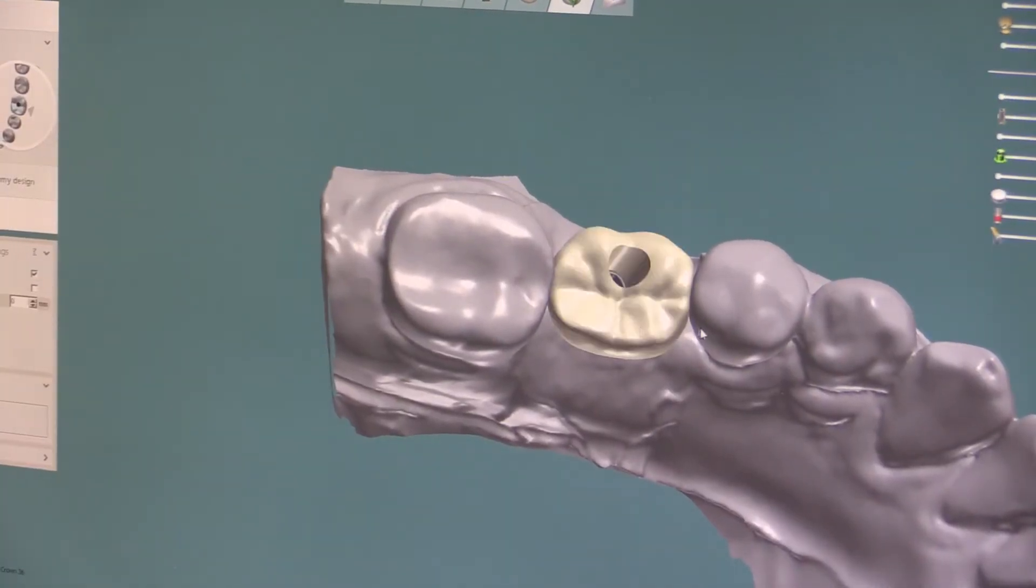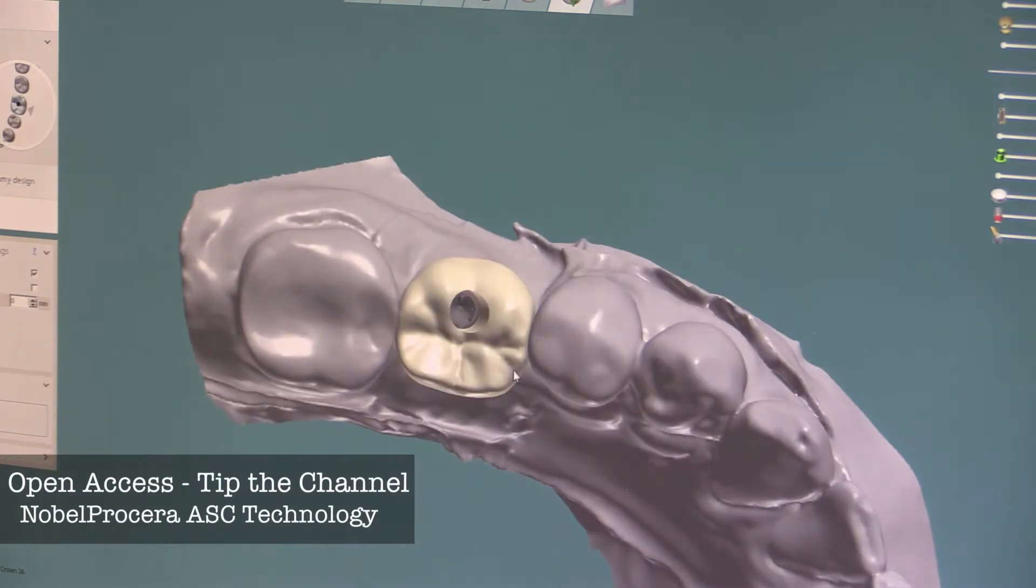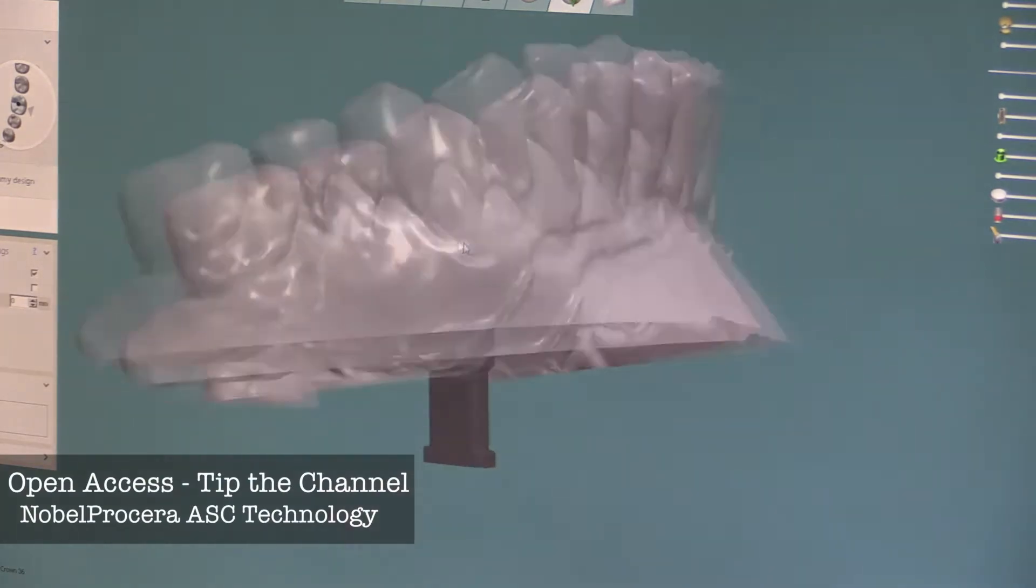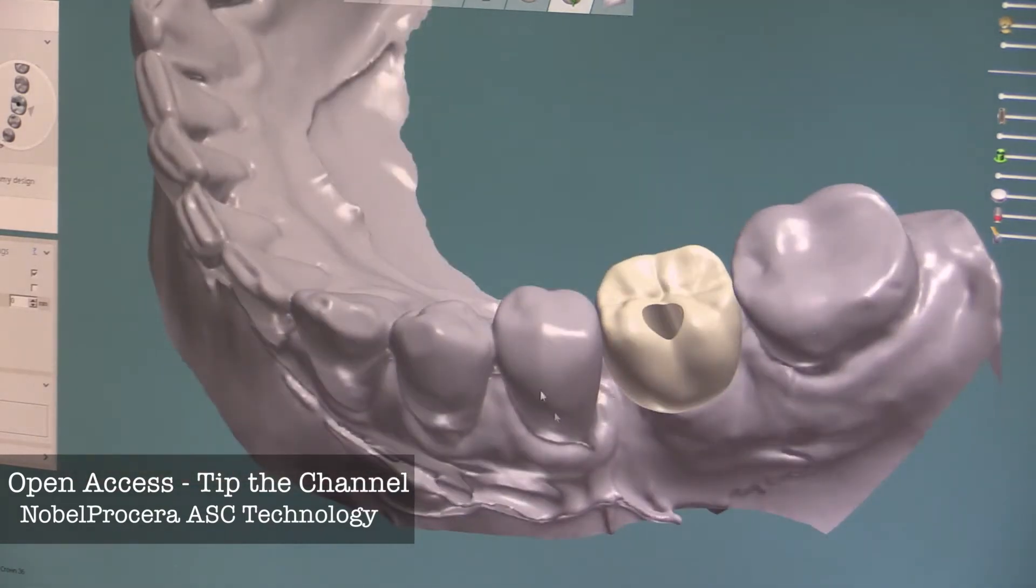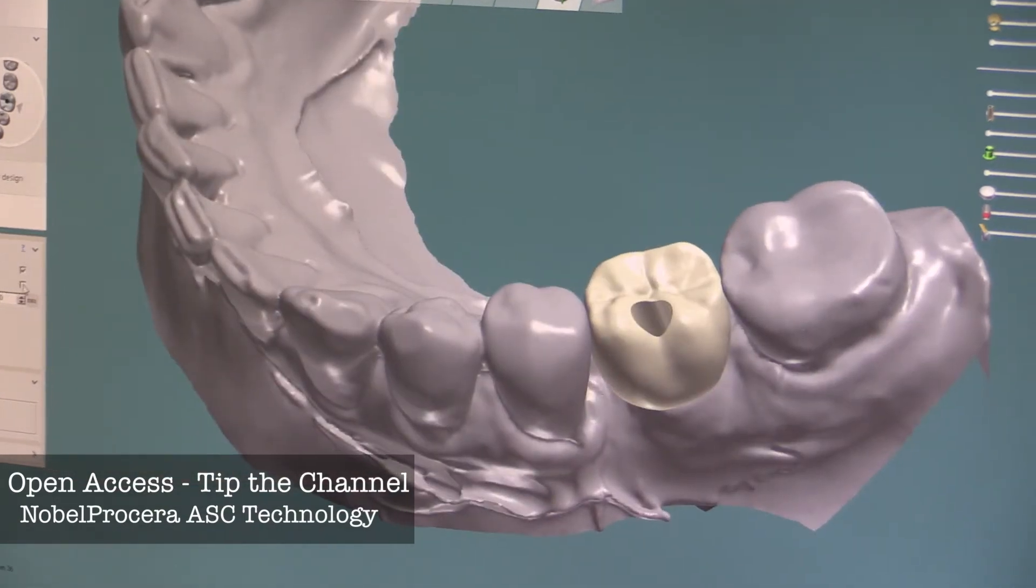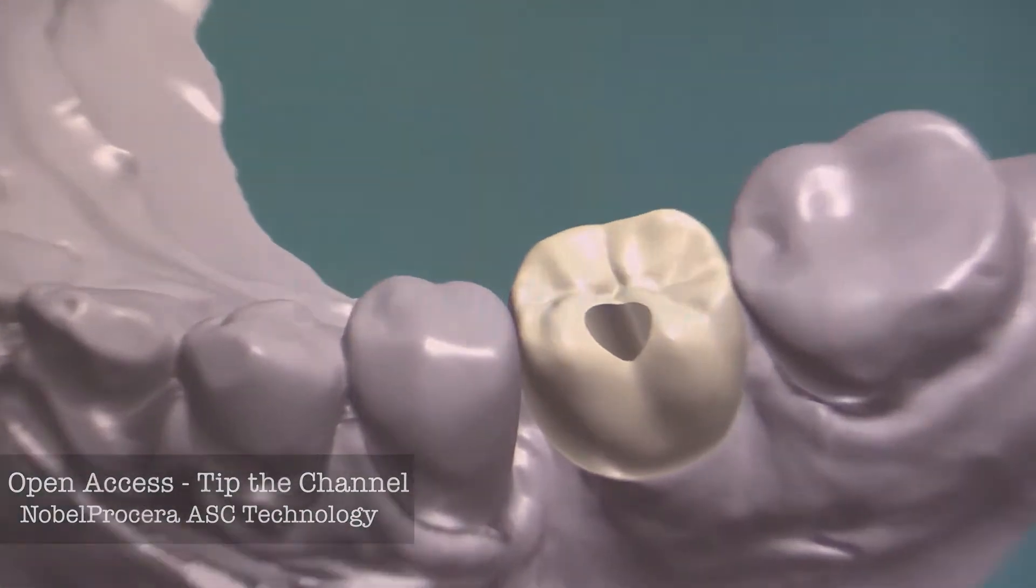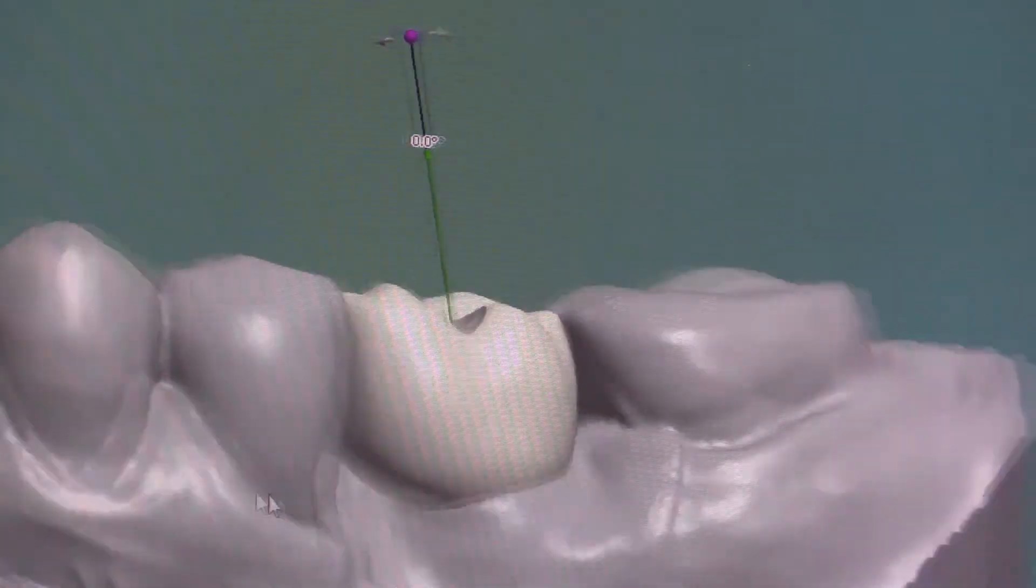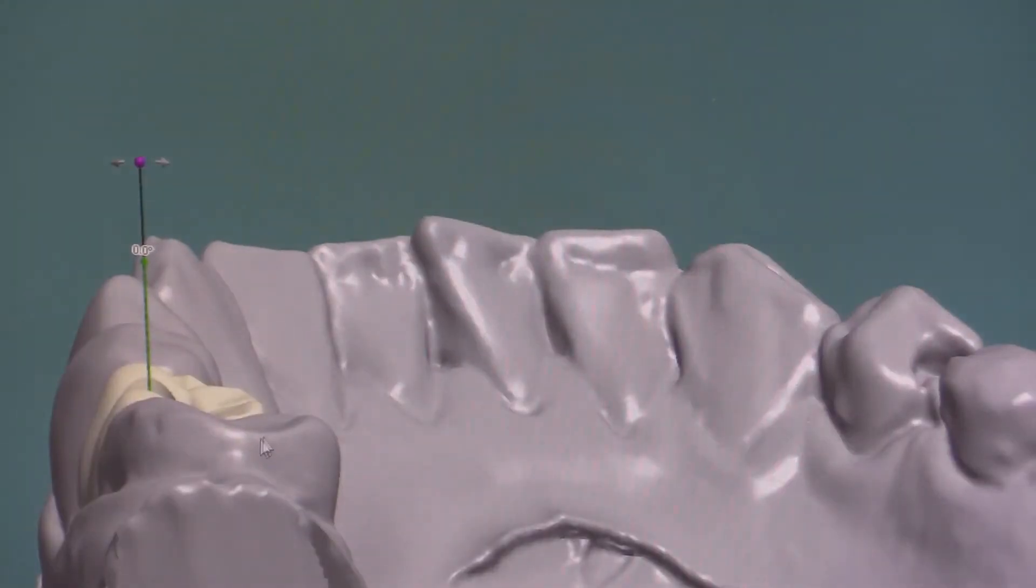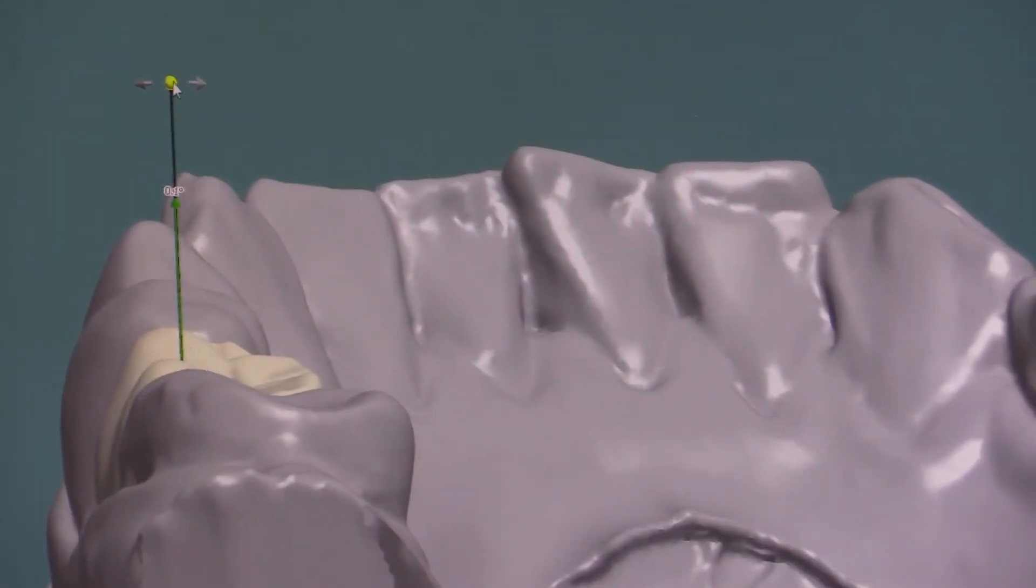So if you start to look at the channel, you can see that the channel is coming out through the facial. The buckle aspect of this is not ideal because this is the functional cusp. And therefore when we would occlude on this, if this was a screw retained crown, you'd be hitting against that restorative resin all the time causing it to wear and tear and break in this area. So not ideal.